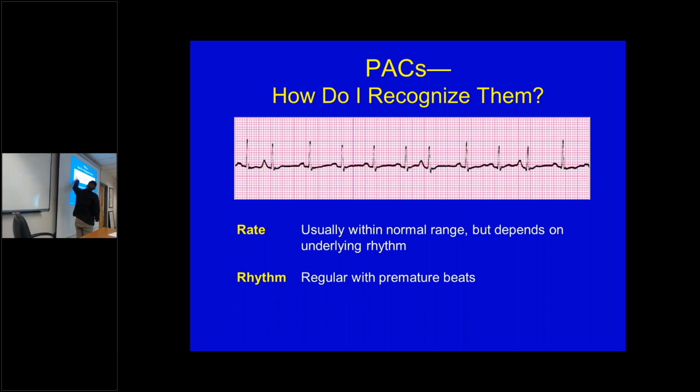So your second complex, you've got this spike in the P wave. So as you're looking at this, normally you want to take your eyes to where there are regular beats. So that spacing looks the same. That space, those are all regular beats. Those P waves are all the same. So then when is it different? It gets shorter right there.